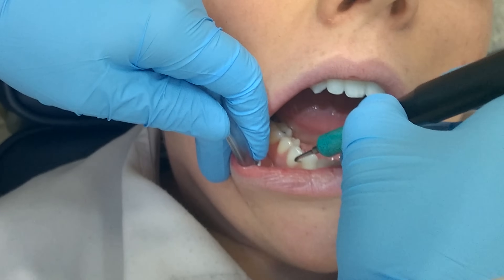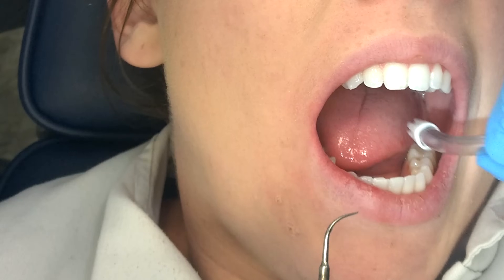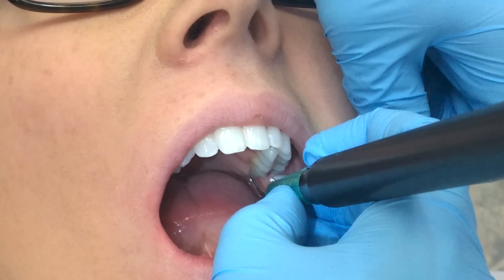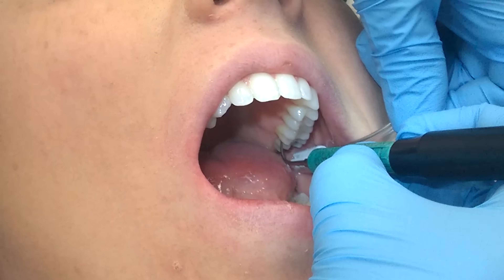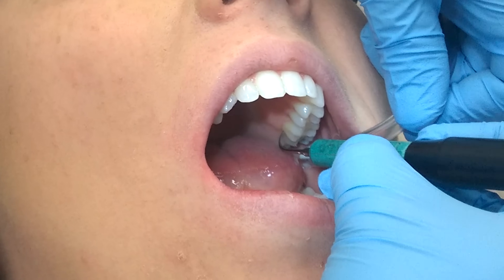Staying here right at nine o'clock, I'm going to move my suction to the other side and retract once again, going right to the linguals of quad two. Still at nine o'clock, I have my patient tip her head up to increase visibility, and I'm still demonstrating holding the suction because my ergonomics are steady here.